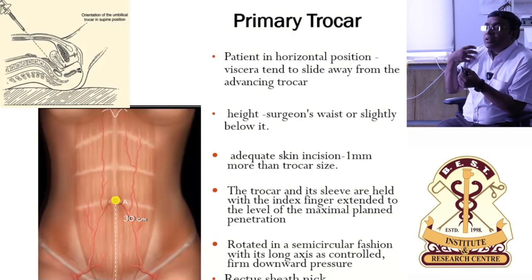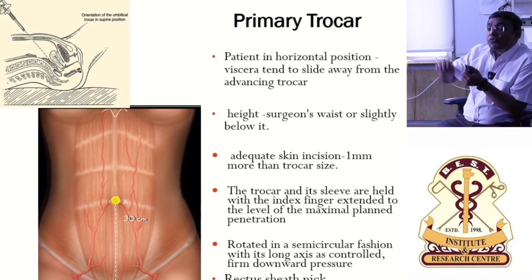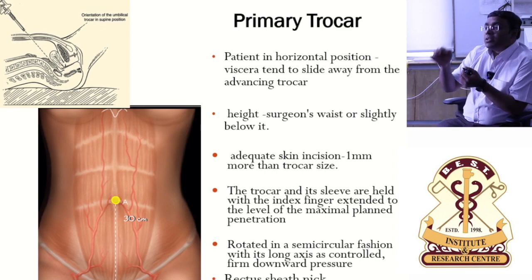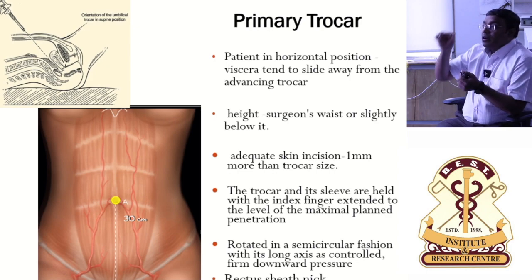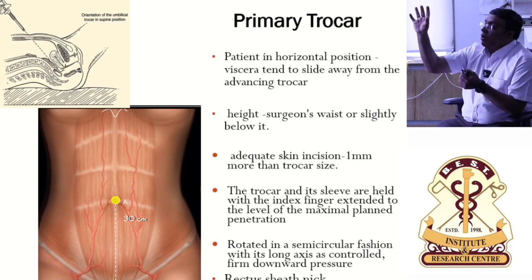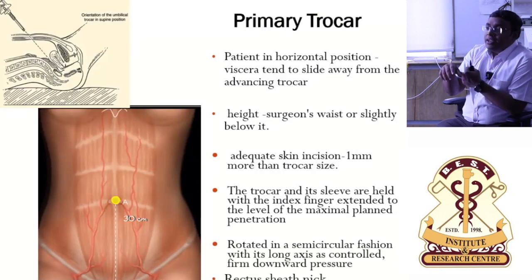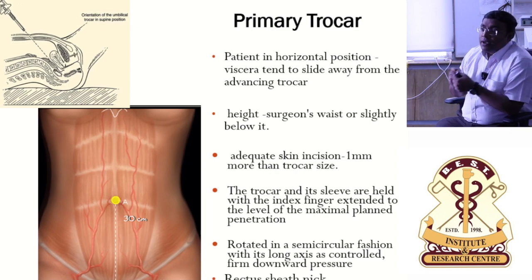It is the shoulder girdle muscle. See, your trocar will require more pressure or more force to pierce the abdominal wall, whereas the Veress needle will not require too much pressure. So the force required to introduce your Veress needle will come from your wrist joint. It's like how you release a dart, with your wrist. So the Veress needle is from the wrist joint, whereas for the primary trocar, the pressure to introduce will come from your shoulder girdle muscles. Okay.